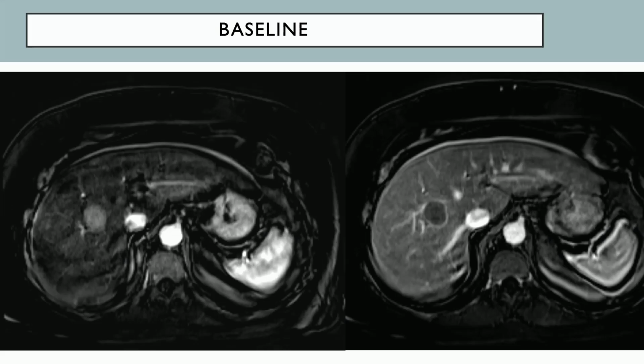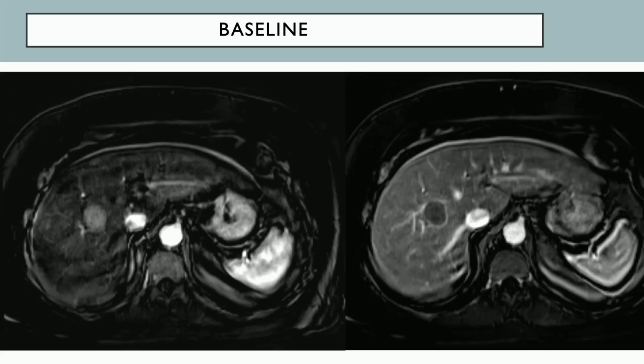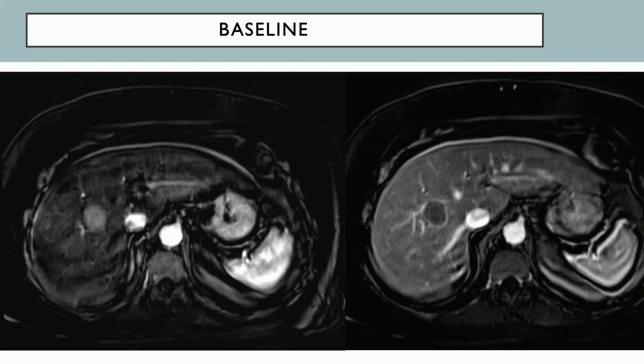I hate this location. Every time I see this, I'm like, oh my goodness, this could be either a disaster with 500 feeders, or it could be a simple case with one or two feeders. Right? Yeah. I had a mapping like this yesterday, and there were 3 feeders. Yeah. And so I feel your pain. And even if you're a very avid ablator, I don't think this is the best ablation location.